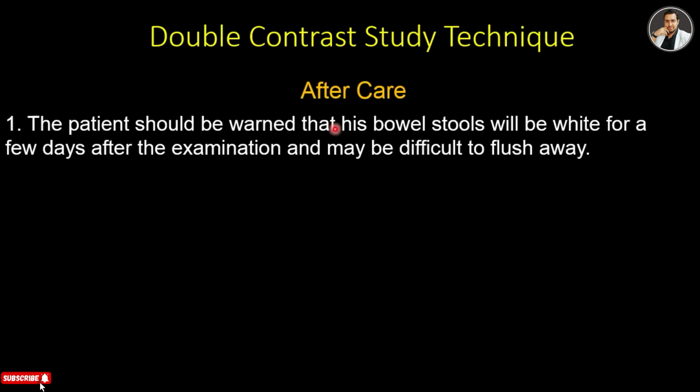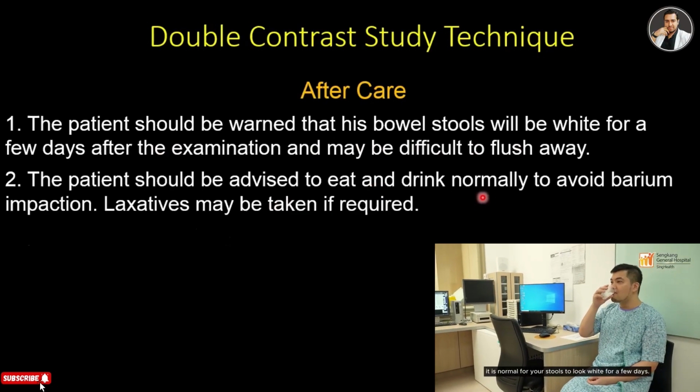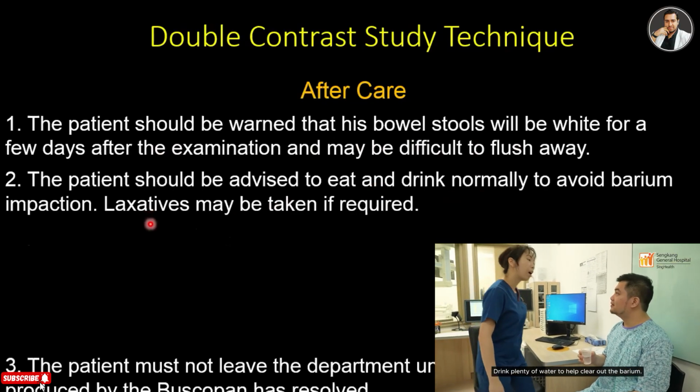There are some problems after the procedure. The first one is that the patient may have stools in white color, white stools. So you have to assure the patient that it will resolve after a few days. And the patient should be advised to eat and drink normally to avoid barium impaction, and a laxative may be given.